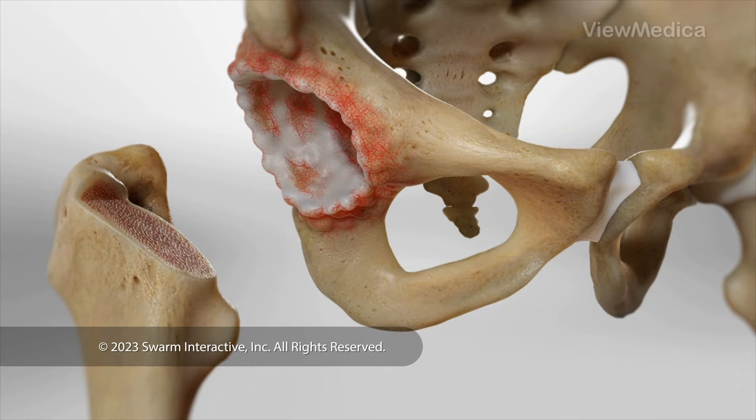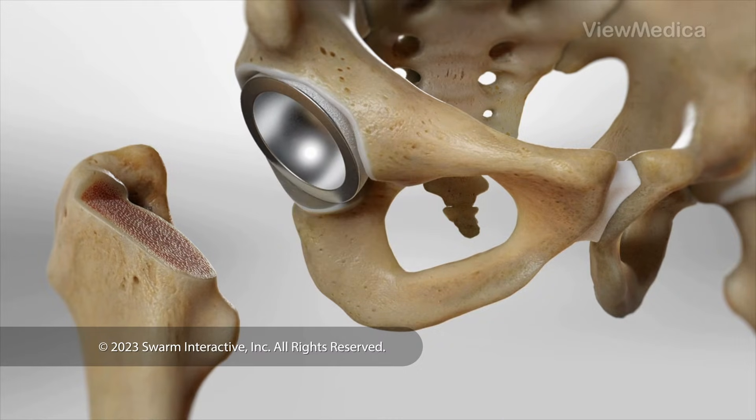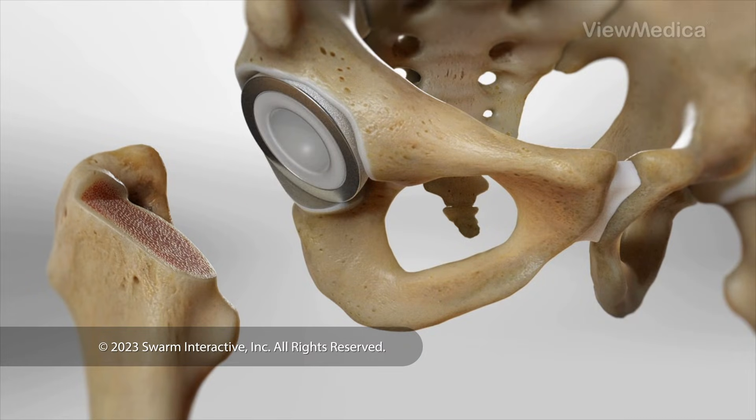Next, we carefully remove damaged cartilage and bone from your hip socket. We fit a metal socket into this cavity. We also press a liner into the socket. The liner creates a smooth surface that will let the ball glide smoothly within it.